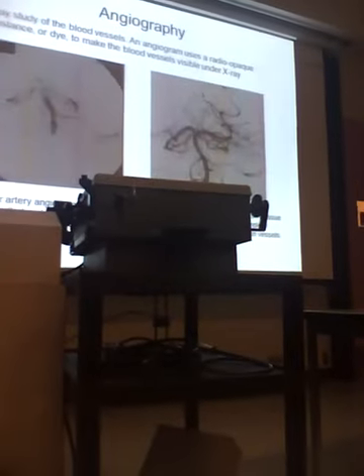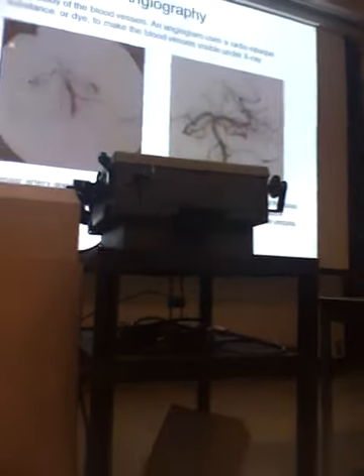You have this type of stroke that clogs up a blood vessel in the brain, and if you get into the hospital within 3 hours, they'll inject this stuff, and what it does is dissolve the clot. And so this TPA was then given to this individual, and now you can see the clot's been dissolved, and you can see this whole network of blood vessels that have been opened up because the clot's gone away. So that's just an example of imaging the blood vessels and seeing the response to this drug TPA. You'll learn much more about this when we do the lecture on stroke later on. I'm just giving you an overview. So that's imaging. Any questions on any of those imaging techniques?